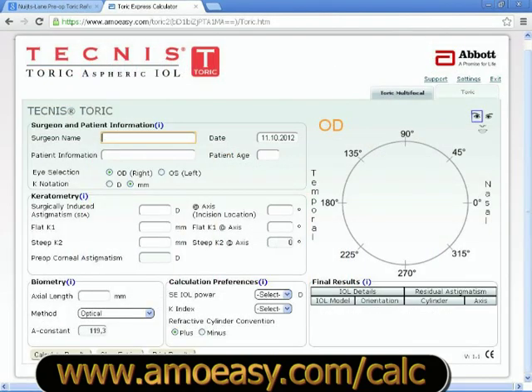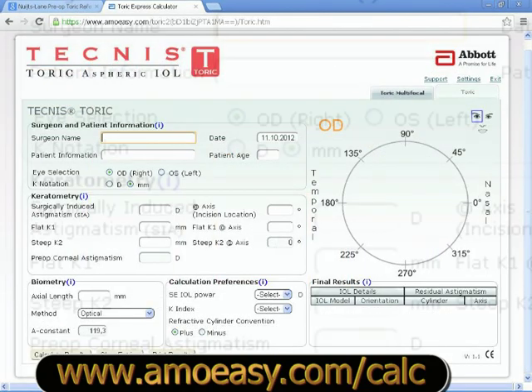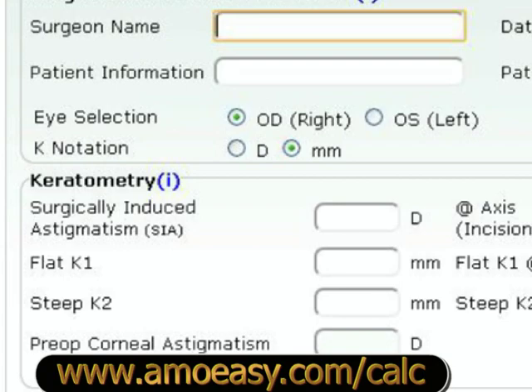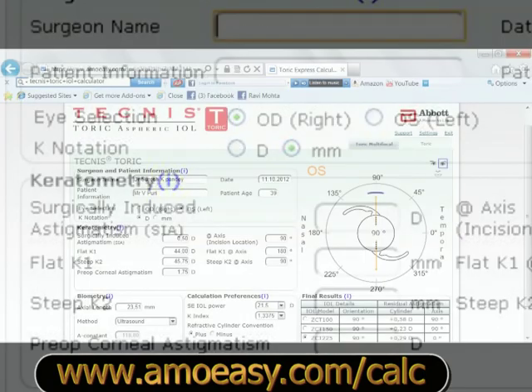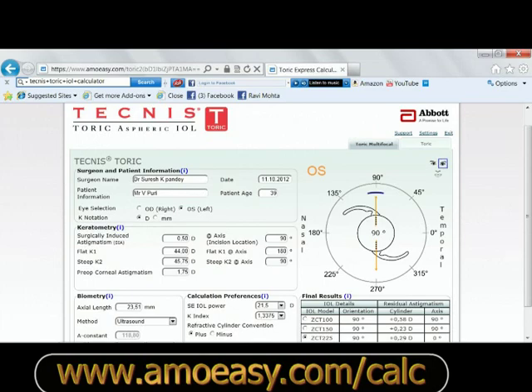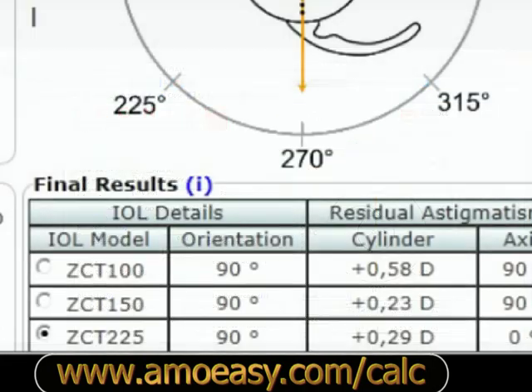Here the surgeon feeds in the patient's data like the keratometry, the steep axis, and the surgeon's surgically induced astigmatism. The website then calculates the model of IOL that needs to be implanted and gives guidelines regarding its implantation. This is a very easy-to-use, user-friendly website available on the internet.